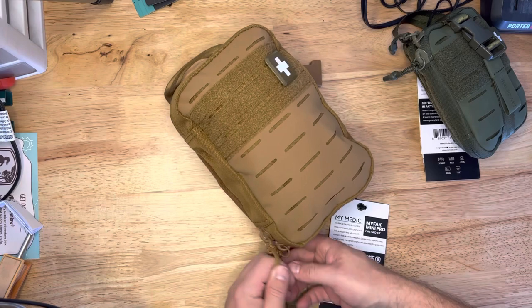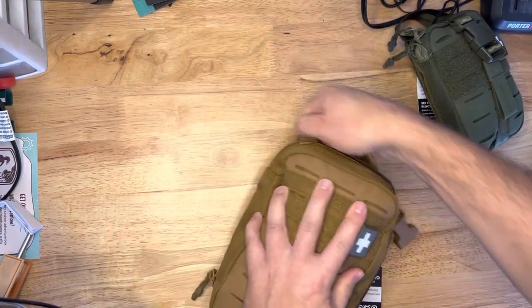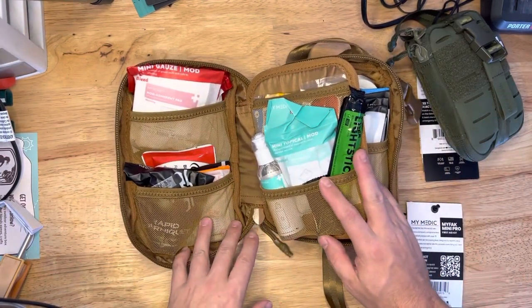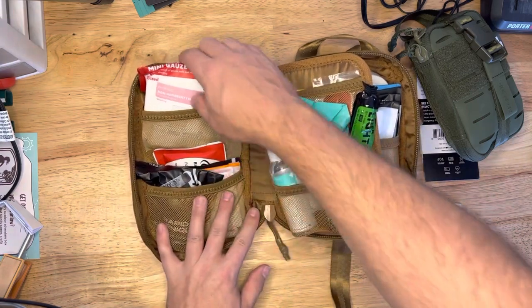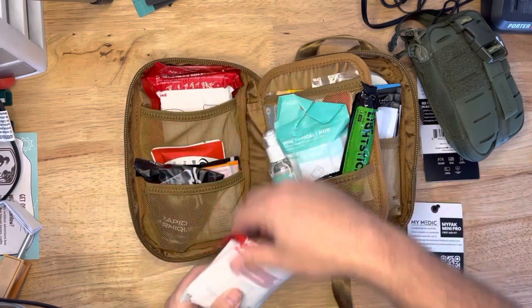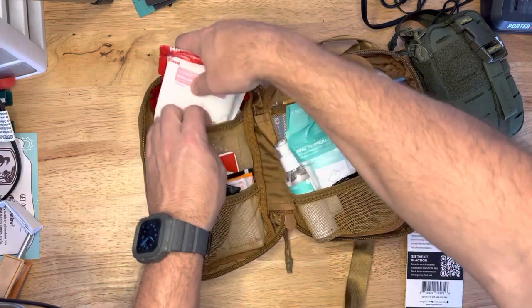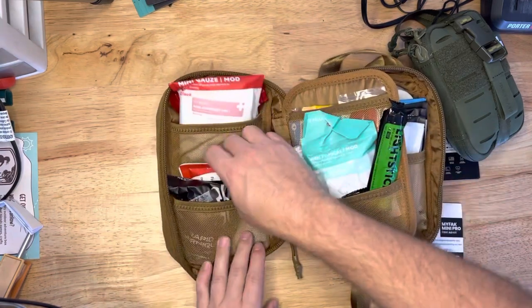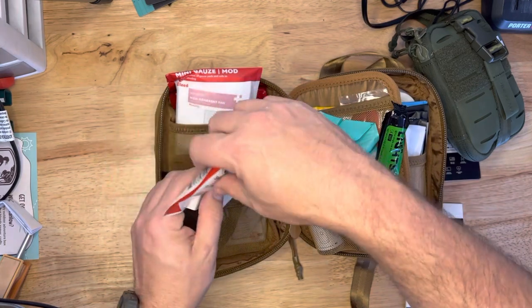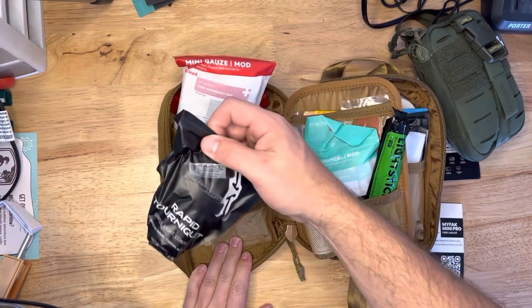Let's open this guy up. Nice, flat, dark earth color — more coyote brown I'm going to say. So we've got a little bit different layout than some of the other IFAKs that I have. Let's take a look at each little compartment here. Over here on the left, we've got bleeding control: mini gauze, a compression bandage, some quick clot hemostatic dressing — it's the rolled kind, which is good — and then a rapid tourniquet.